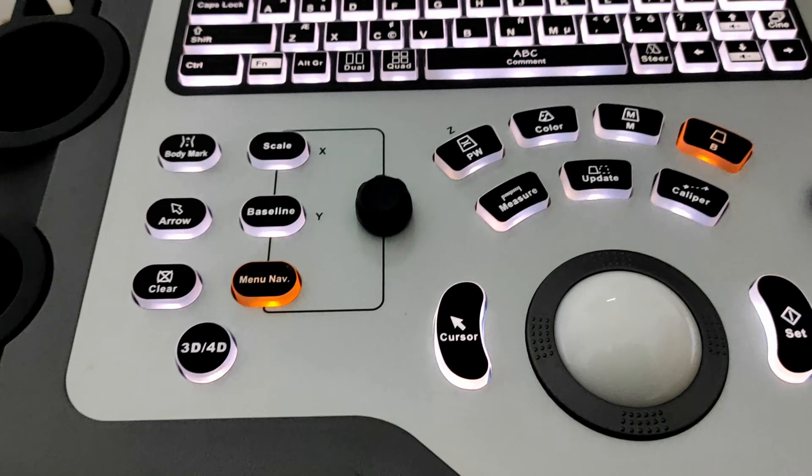This one is our cursor button. When I press it, a cursor will appear on the screen. Press it again and it disappears.